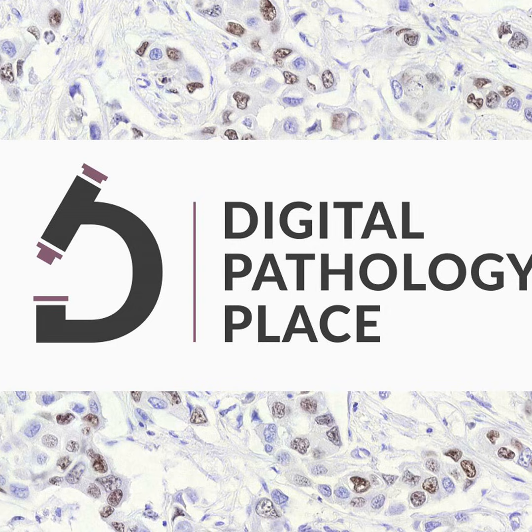Yeah, I mean, that was really exciting, I think, for the image analysis world too, right? Something that you can't capture visually, or is very hard to capture visually. And from an image analysis perspective, it's a relatively simple calculation, right? You're looking at all the immune cells, you define the tumor border, and then you just measure that infiltration region.